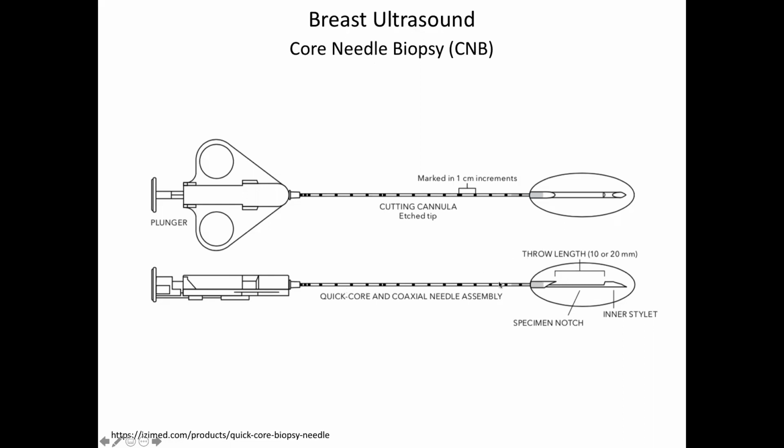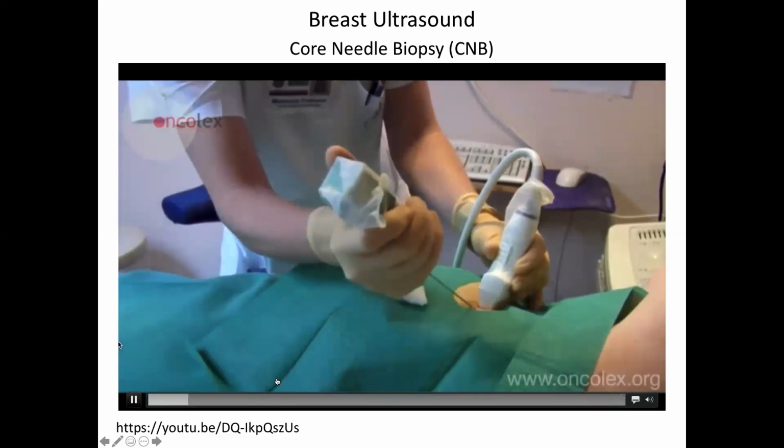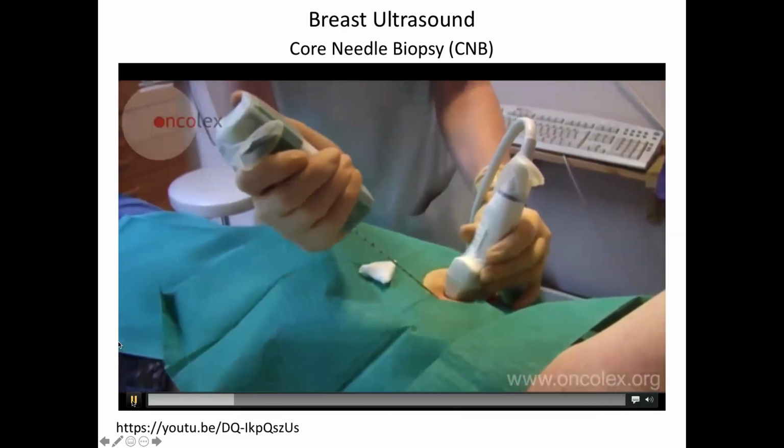And so you have an outer cannula or needle part. Inside there, you have this stylet, which is a really sharp thing. It has a little scoop on the front. And what's going to happen is we're going to move this right into the location, so that we know this will advance about 2 centimeters or a centimeter. You set it out in front, and then it'll suck a chunk of tissue back into the cannula, and you go and look at the cells, right? And so here, do I have a, oh yeah, okay, good. So here's the device itself. You can see here's the markers, right?